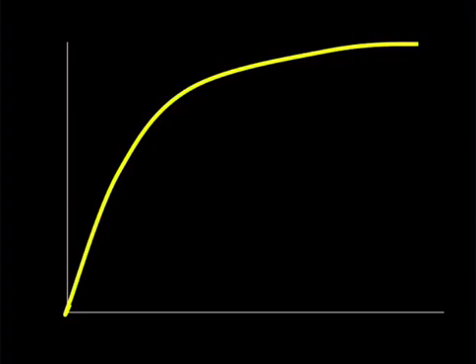The rate of the recovery is an exponential process, with the recovery time constant, or T1, defined as the time it takes 63% of the longitudinal magnetization in the tissue to recover. So in other words, right here, that's T1.